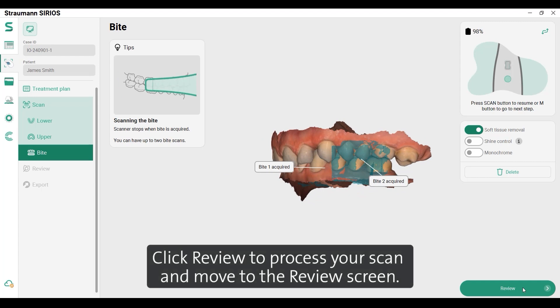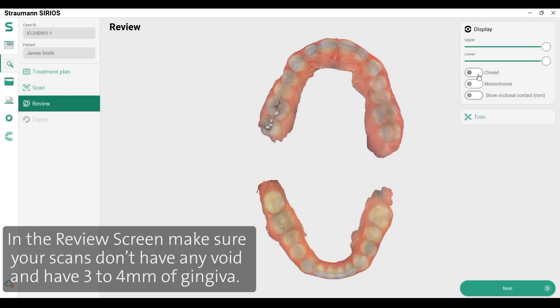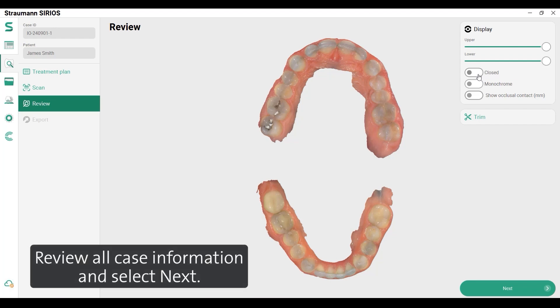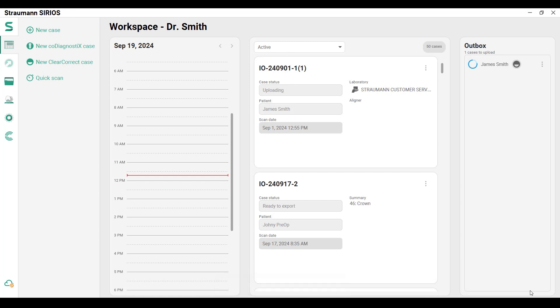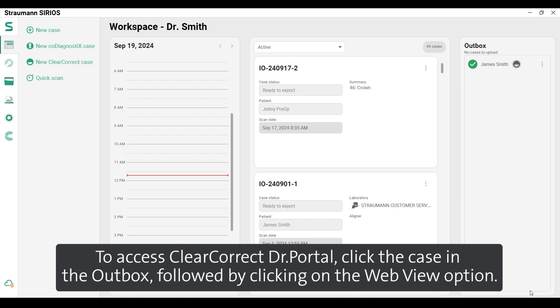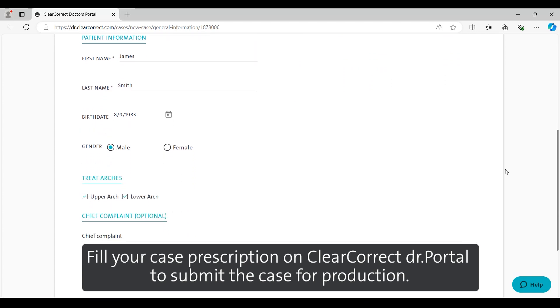Click Review to process your scan and move to the Review screen. Make sure your scans don't have any voids and have 3-4mm of gingiva. Review all case information and select Next. Select Send to export the order to ClearCorrect Doctor Portal. To access the portal, click the case in the Outbox, followed by clicking the Web View option. Fill your case prescription on ClearCorrect Doctor Portal to submit the case for production.